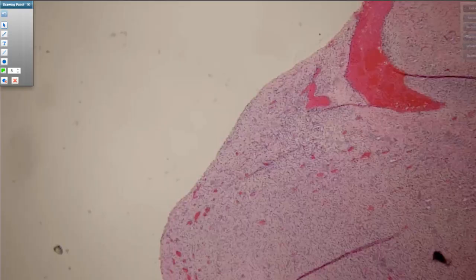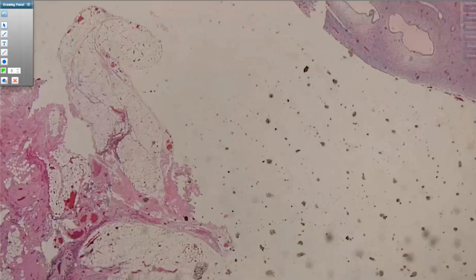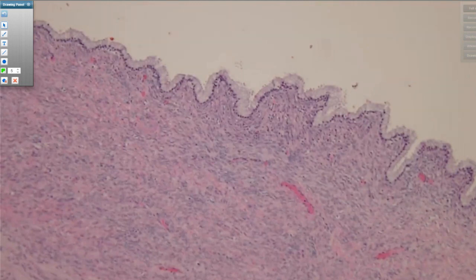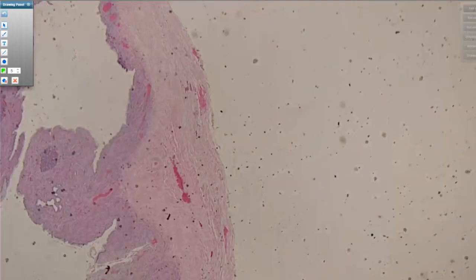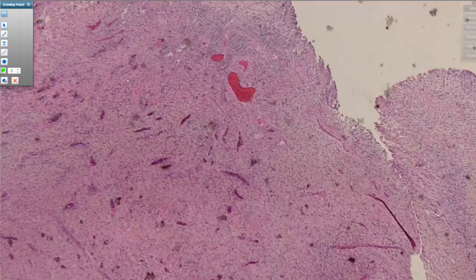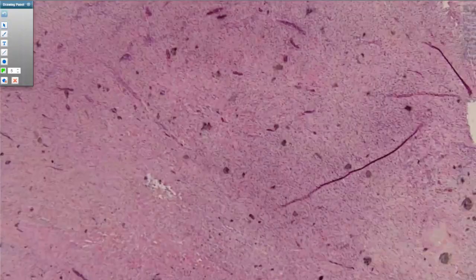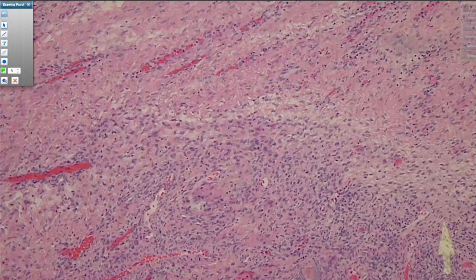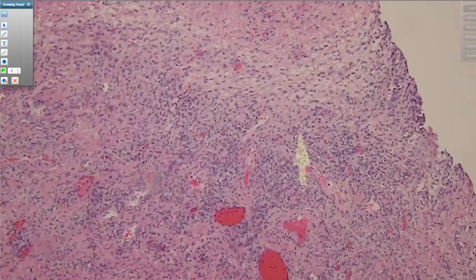And it can be tricky then. In this case, we were lucky, you had beautiful areas with your mucinous cyst lining associated with the stroma, so no diagnostic problem. But you can certainly get cases where you really have almost nothing but this degenerative stuff. And that's, again, where putting the whole cyst in will help you to identify maybe that focal bit of mucinous lining. I'm just highlighting here how all this degenerative change blends into what seems like it might be a little bit of your cellular stroma here.